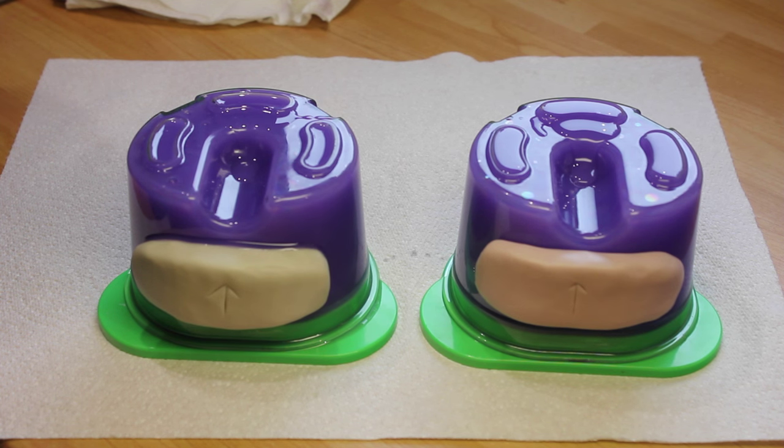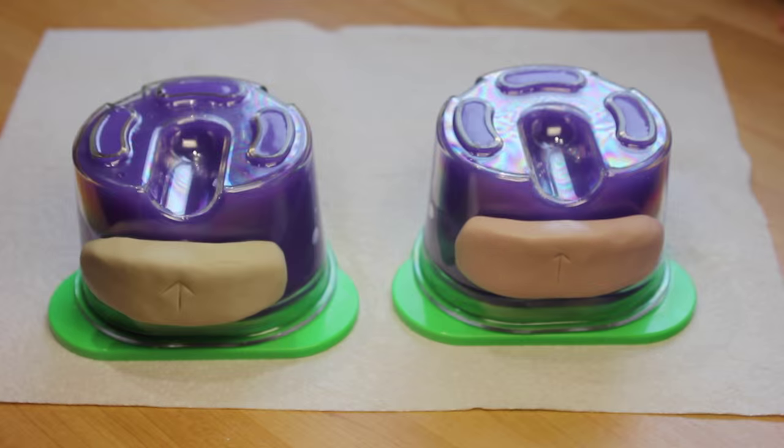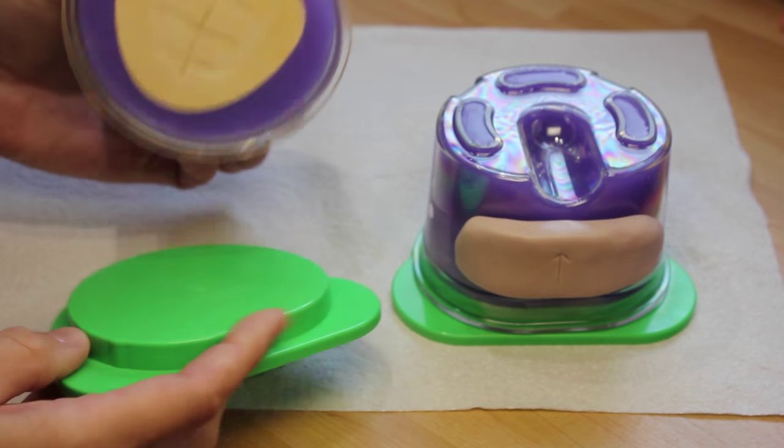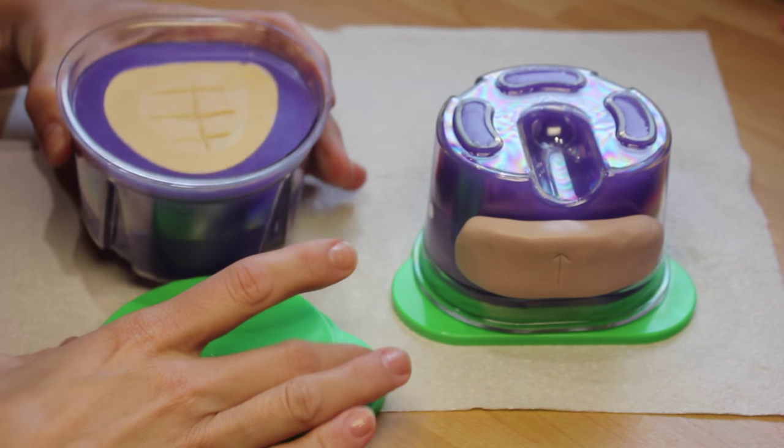These flasks hold about 250 to 300 milliliters of duplica depending on the model size. Once the silicone has set — with this one it's quite quick, about 16 minutes — you can open the flasks and remove the models.